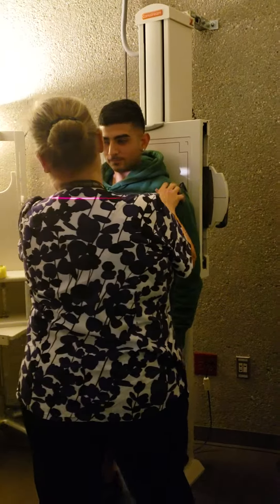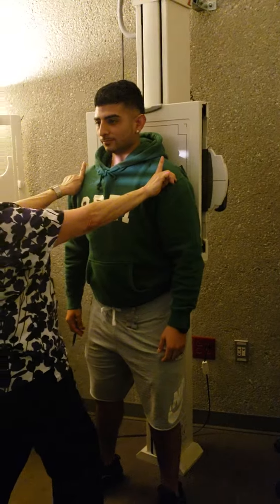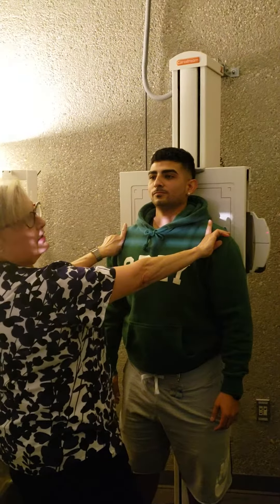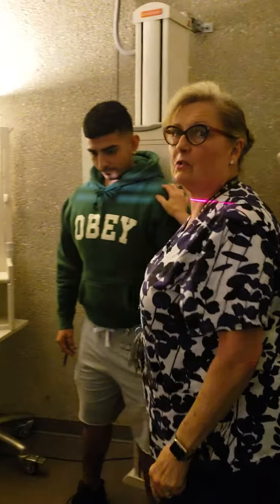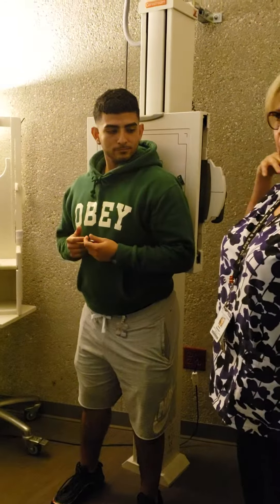I'm helping him from his AC joints, and it would be close on him. See where my shadows of my finger are? I'm going to go over just a little bit. It's really close on the light. So probably in his case, I would do individual, because he's got large muscles here, but he's also broad in the shoulders.